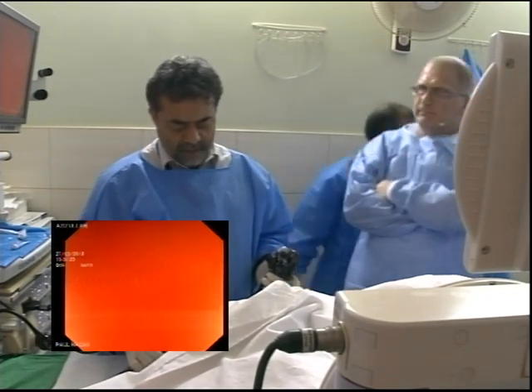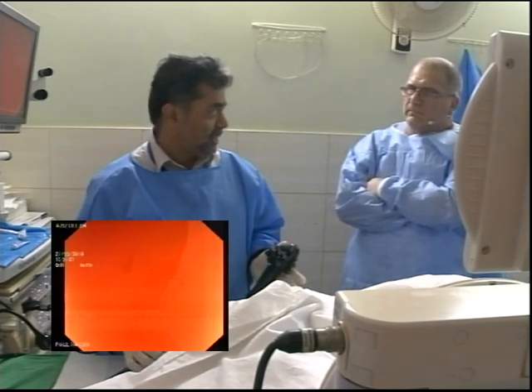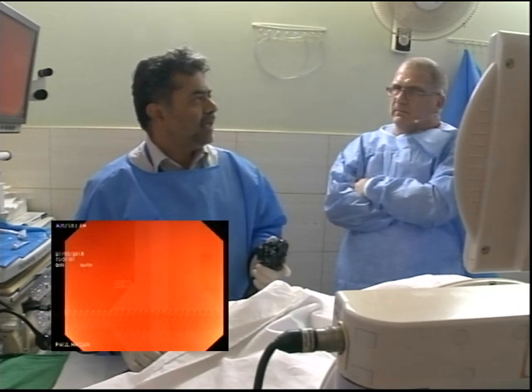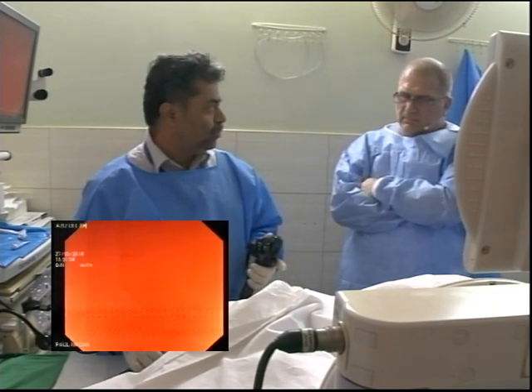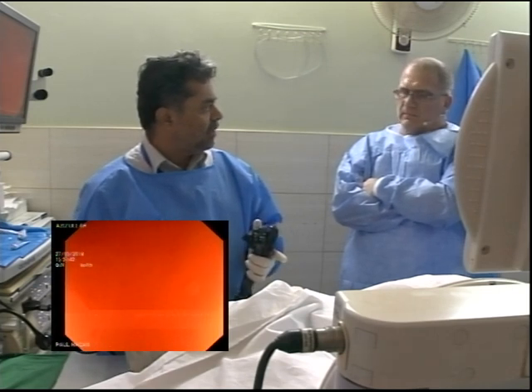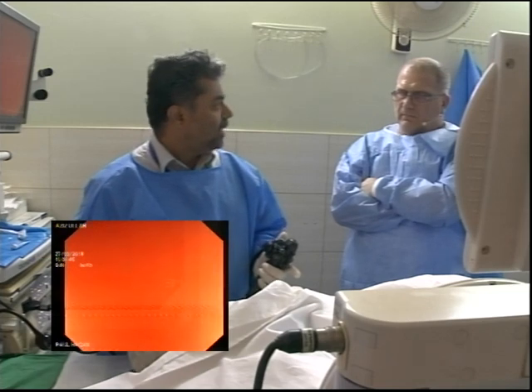Oh yes, I learned from the course that I practically want to demonstrate right now. I have a problem in looping, which I had when I was doing it yesterday, and I understand a little bit, and I tried my best to do it here. Because of both the sides, it torques on the anti-clockwise and the clockwise, and just reduce, and then go ahead, and then advance.